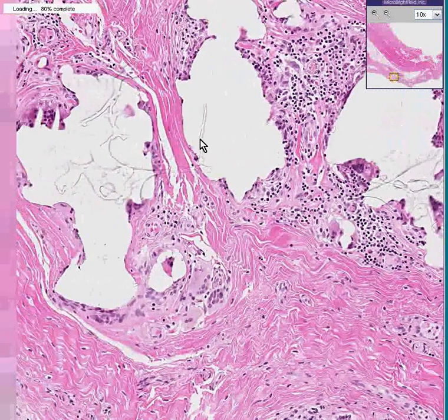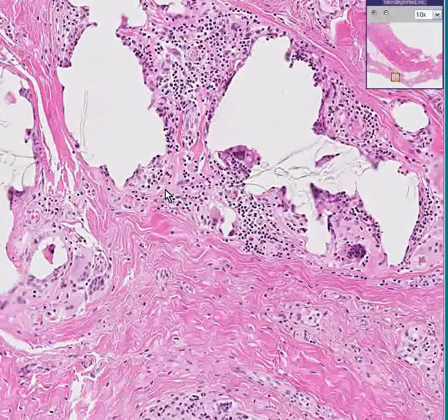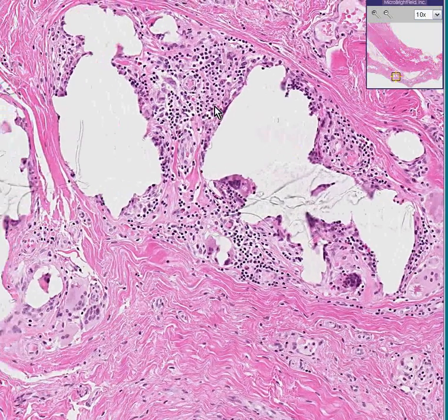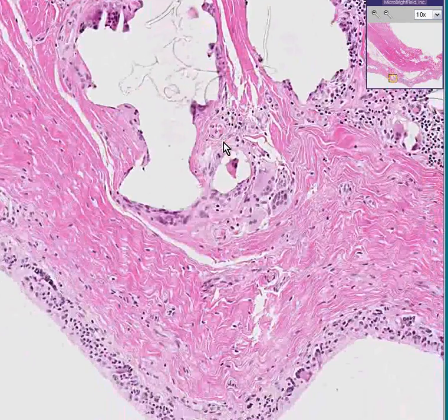It could very easily have this foreign body granulomatous or foreign body giant cell reaction as well. One very nice thing to do — if you are not really sure whether this material or that material is really foreign material or not — is to just polarize the condenser on your microscope. If any of the material you are suspecting as foreign somehow becomes refractile or glitters a little bit within the reduced light of the polarization, then you could be sure that these cells are reacting to foreign material, because much foreign material is very refractile under polarized light, as is some normal tissue material as well.